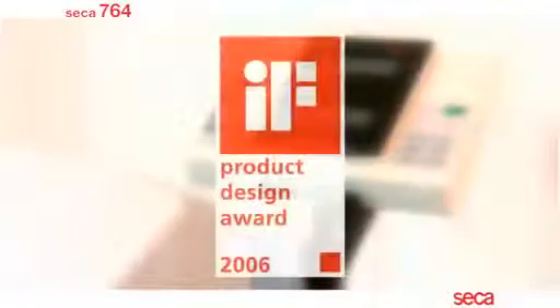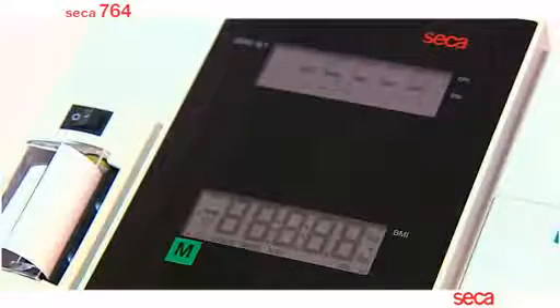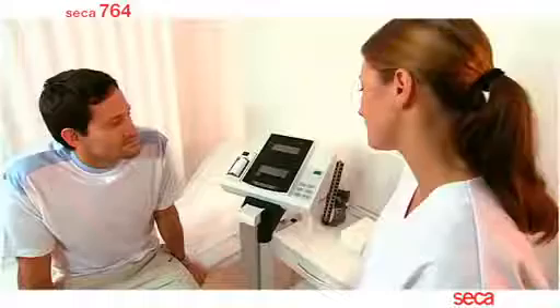An image of functionality and design, the Class 3 approved seca 764 with integrated printer is the complete digital measuring and weighing station. The practical angled display incorporates an easy to use keypad, integrated printer and two large LCD displays which are activated when the scale is turned on.